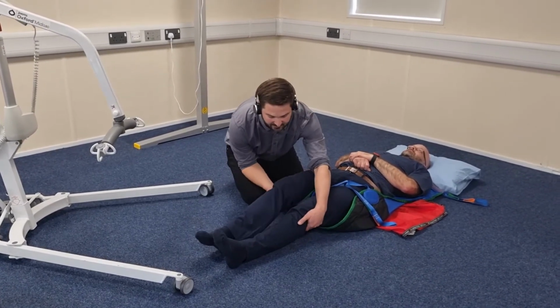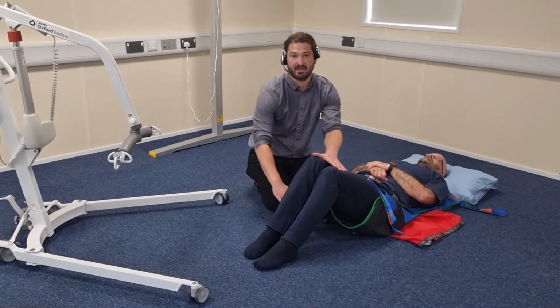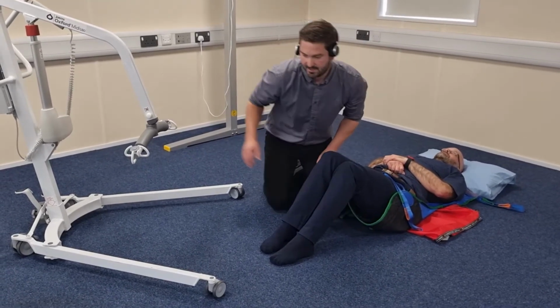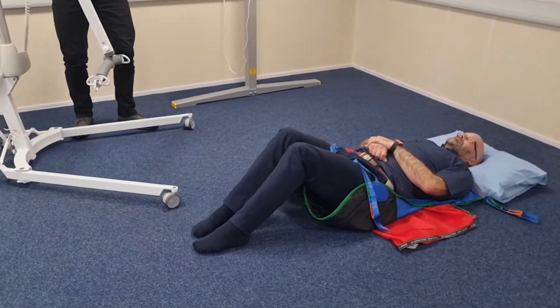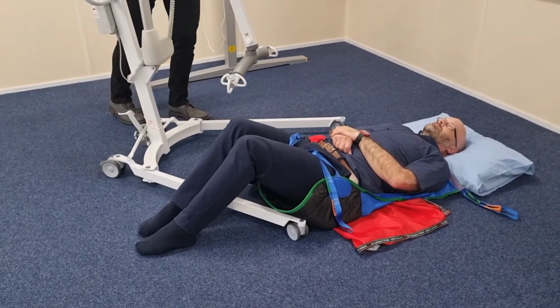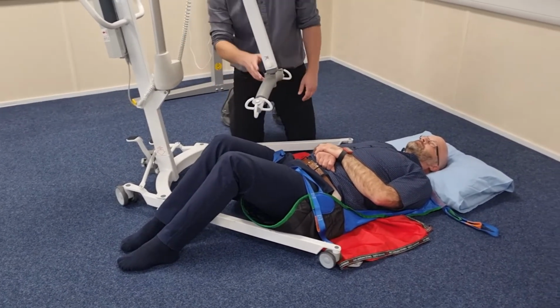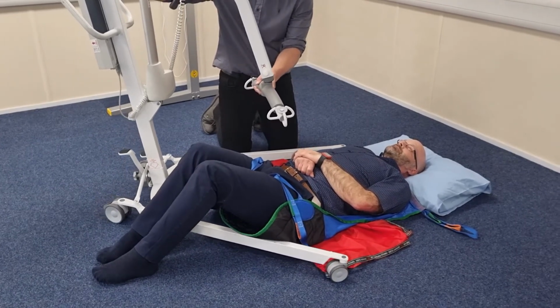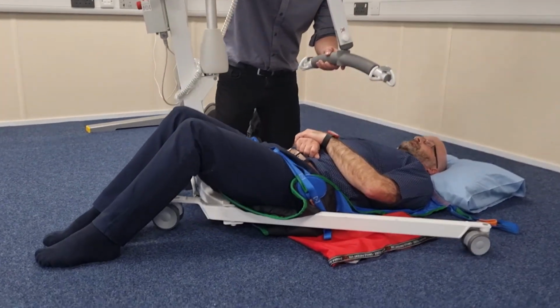So what I'm going to do is I'm going to ask them if they can either lift, or I'm going to support the knees up. This then creates access underneath for one of the hoist legs to pass through. I can then begin bringing the mobile hoist in. So the legs will be splayed out, and this is going to pass through. As I'm doing this, I'm being very careful of the metalwork, not causing any injury to the person while I bring this in. I'm going to bring it in as close as I can.